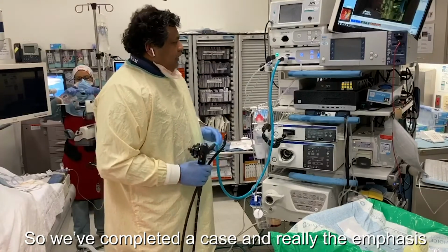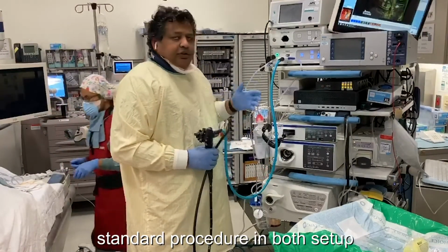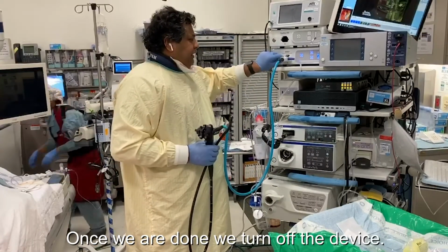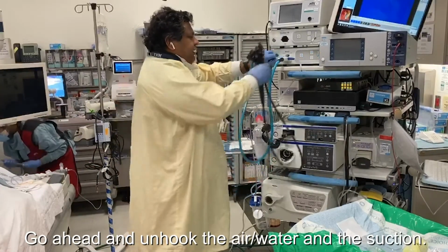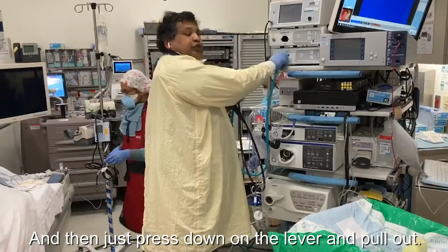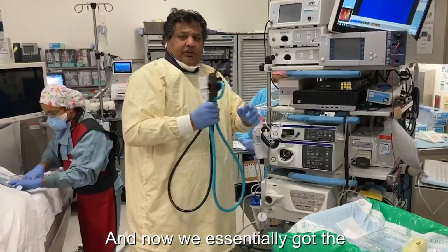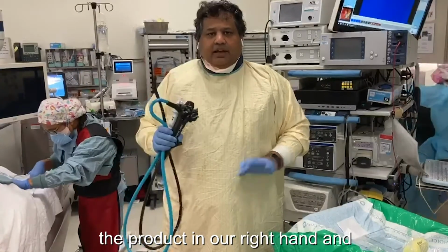So we've completed the case, and really the emphasis is that it's very similar to your standard procedure in both setup as well as the performance. Once we're done, again, we can basically turn off the device. Go ahead and unhook the water and the suction, and then just press down on the lever and pull out, and we've got our device here. And so now we've essentially got the product in our right hand, and it's extricated from the base unit.